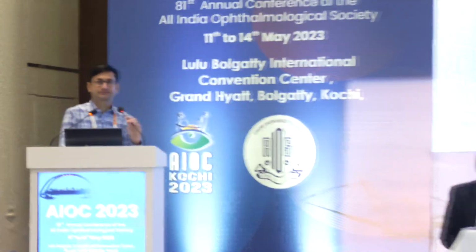Yeah, Anirudh, fantastic talk. Just wanted to ask you about the outer retinal infiltration which you were showing. Is it the same as the contact sign which we talk about in cases with a granuloma, tuberculoma, or a sarcoid granuloma? Is this the same as one? And my second question is, what is your take on using pseudocolor imaging or multicolor imaging in cases of uveitic entities, especially the non-infectious uveitis?